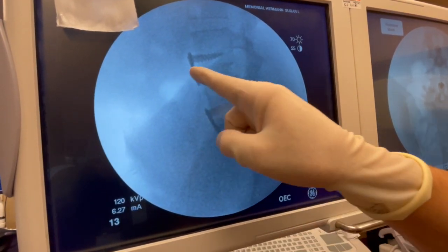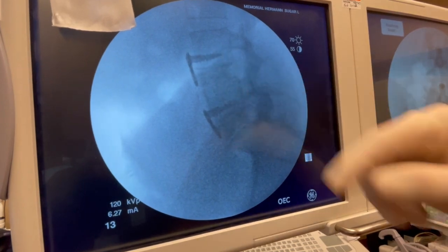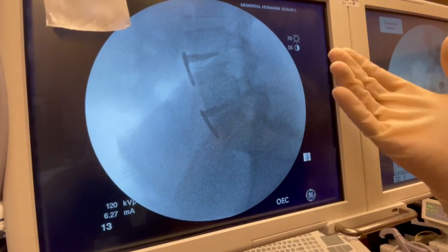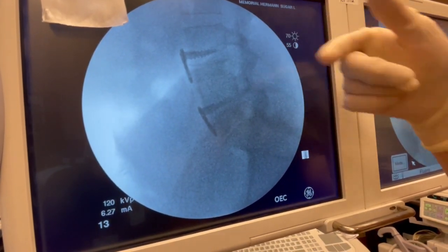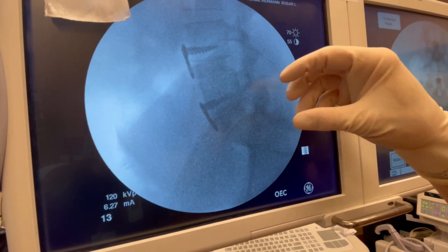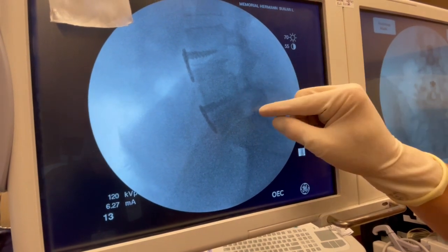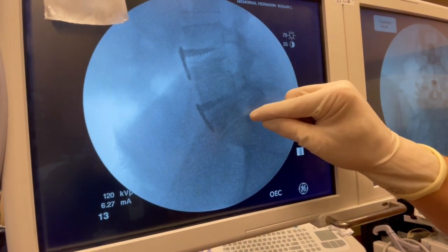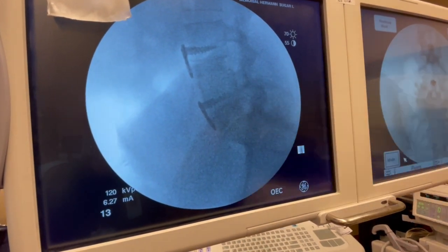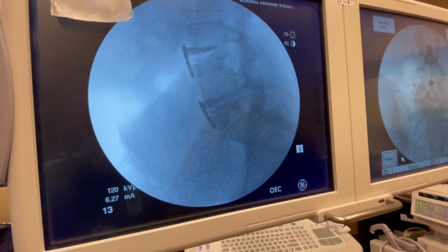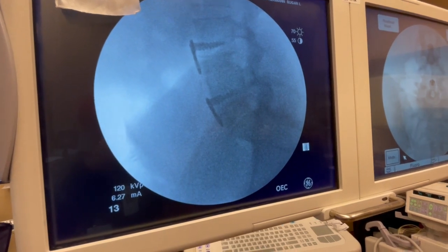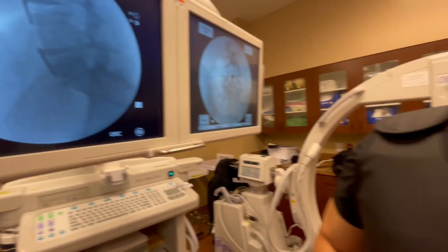These grafts and plates were placed from the front. Next, we'll go to the back of the spine to stabilize it further, remove part of the bony arch, and remove the fragment sitting down in the spinal canal to make sure her nerves are totally free of pressure. Give her a stable spine and free the nerves — that's the goal today.